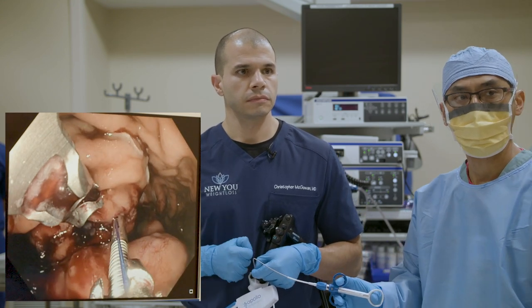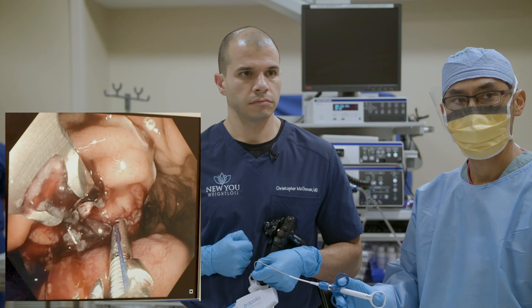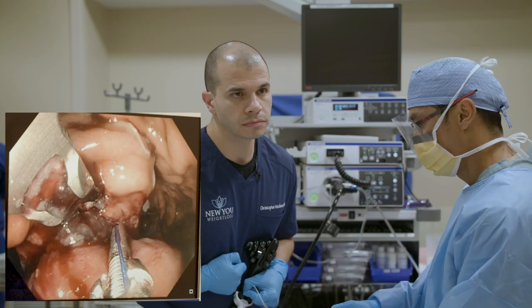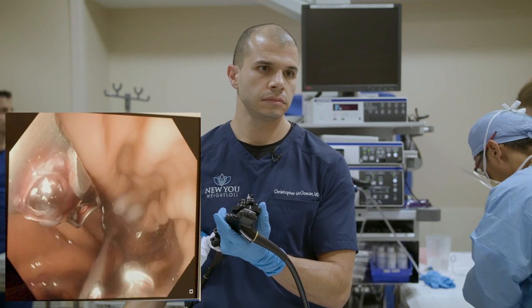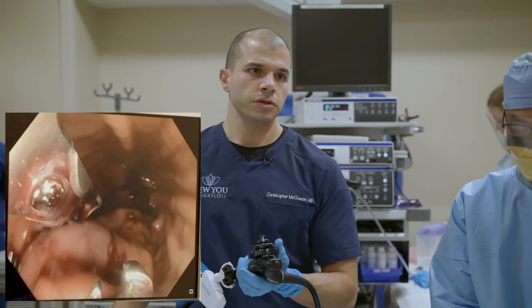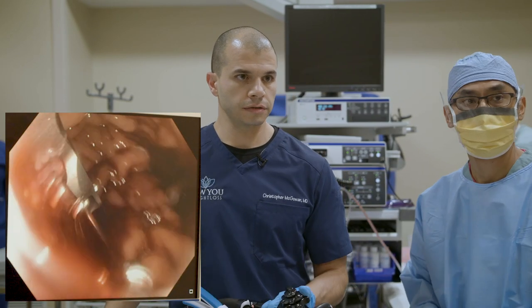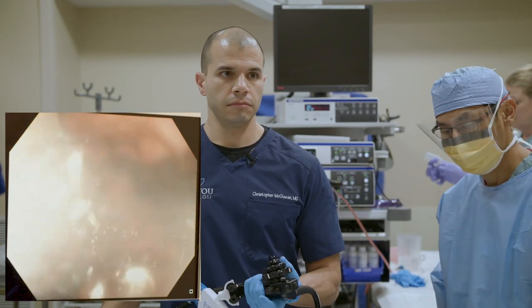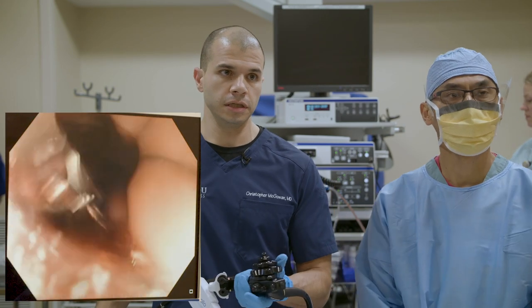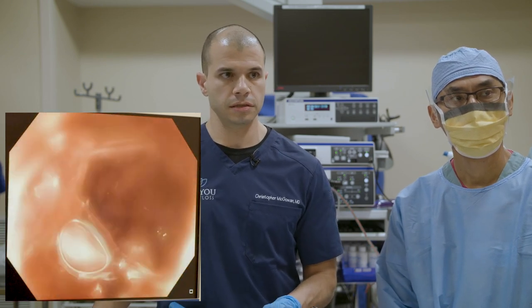We're cinching this one. Over time we just get used to how much tension to put on these sutures — if we over-pull, we could break it. That's looking good. Question: what if ESG doesn't work for me — am I allowed to have another weight loss procedure? Yes. A weight loss procedure doesn't always work for everybody. While ESG is technically permanent, you can go on to something else if needed — such as a gastric bypass, potentially a surgical sleeve, or duodenal switch. That's still an option if needed.